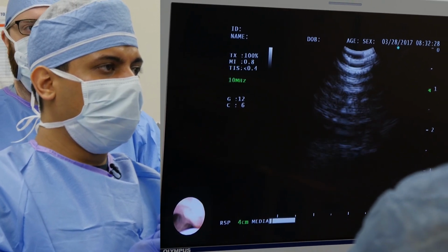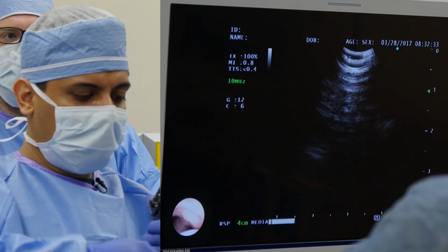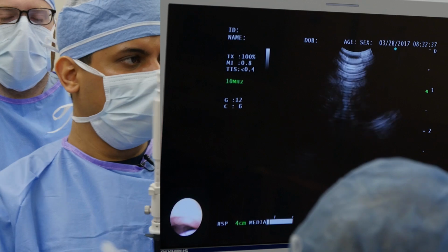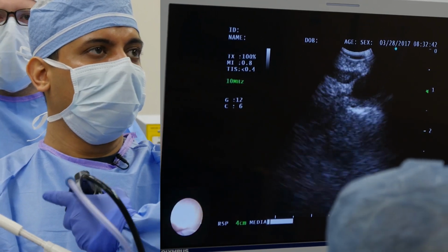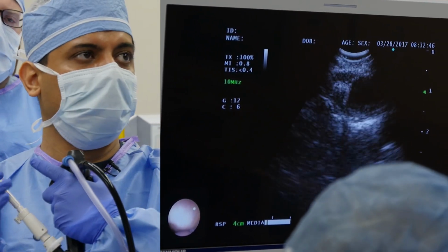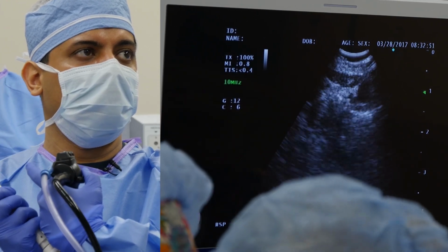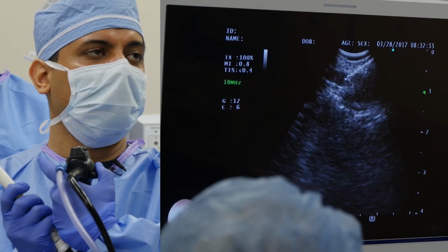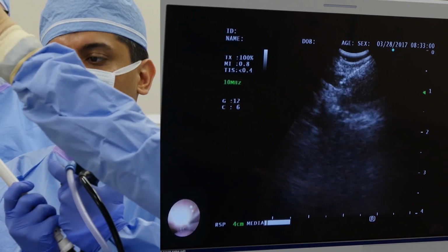So I'm measuring my sheath there, and it's just inside the view from the camera, which means it's outside this working channel. And I'd go back to 11R. All right, take the suction out, please. Might be easy to come from. Yeah, take it out.